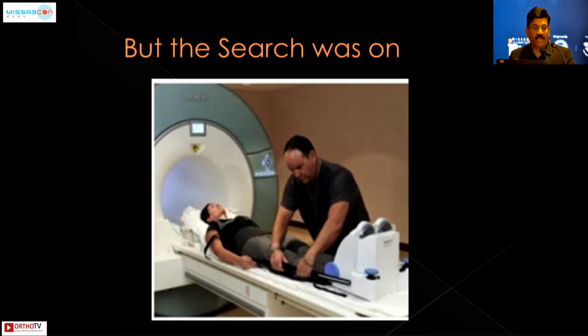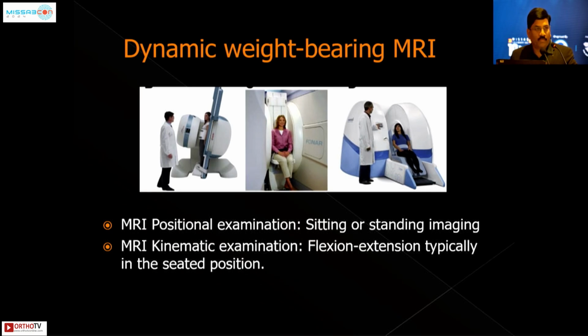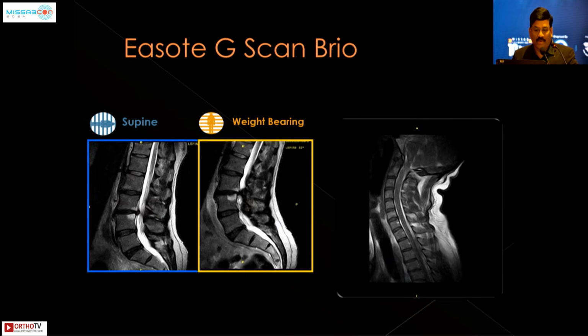But there are some attempts to do that by applying an external device, like the Dyna vest, which is an MR compatible compression device. It's like a vest attached to the chest, and then there is a foot plate. We apply compression inside the MRI gantry to reveal what exactly happens when the patient is in supine position. But now different technologies of load-bearing MRIs have come up, which have the potential to be taken sitting, standing and in movement as well.